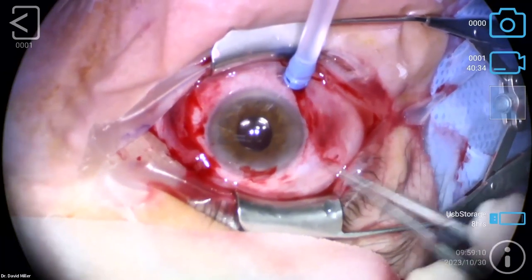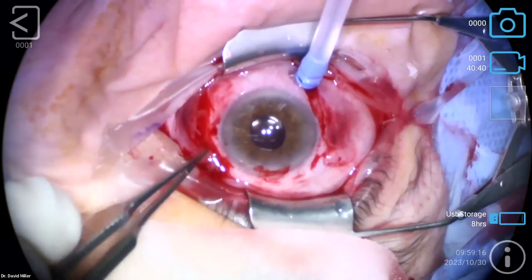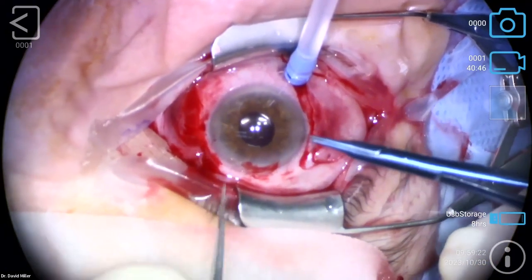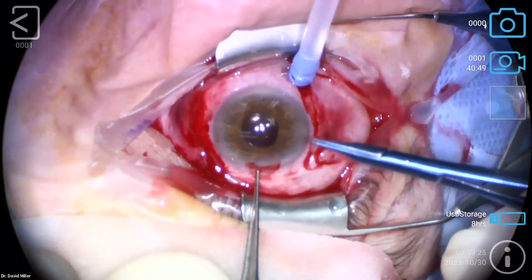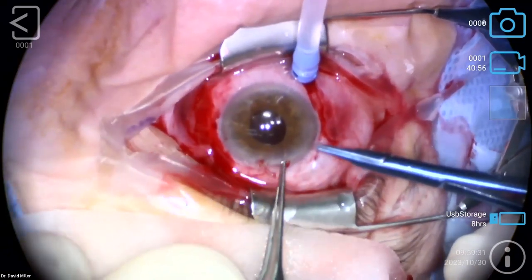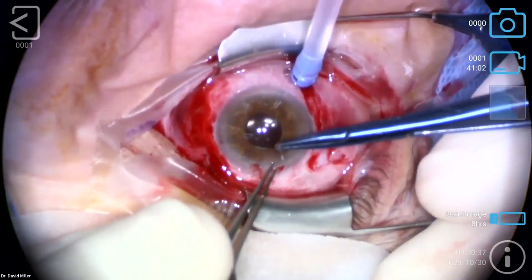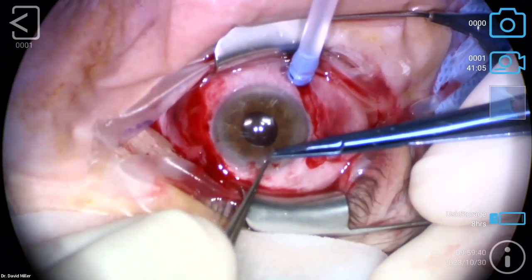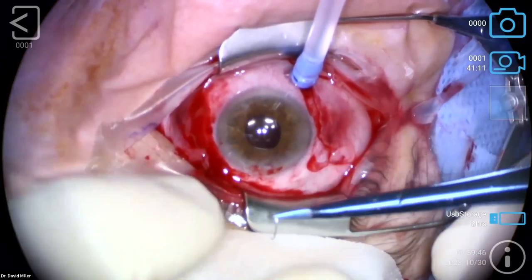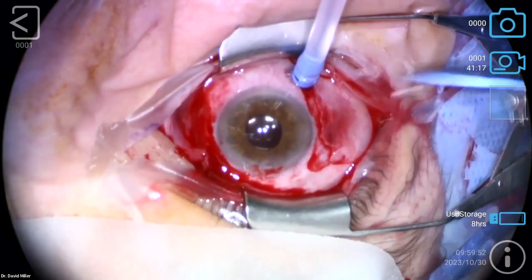And so you got the Tenon. Yeah, this will work. I do tend to check the wound here a little bit. So this wound's actually watertight, but again, I don't trust my wounds like I would some of the cataract surgeons. I'm not making these that often. I tend to always throw the stitch, feeling that I'm a little safer in terms of lowering my infection chances. That's where I'm a little more comfortable.